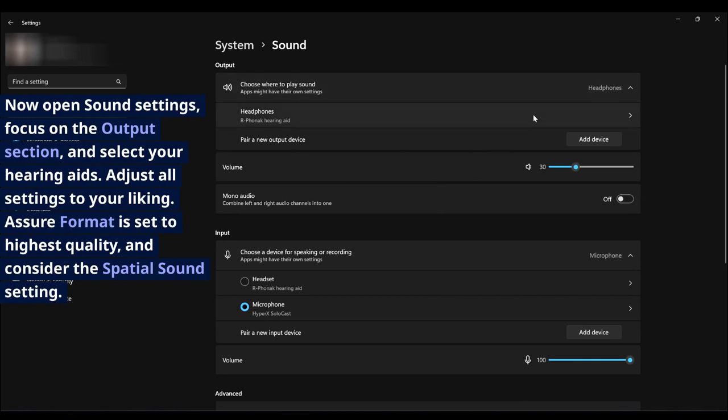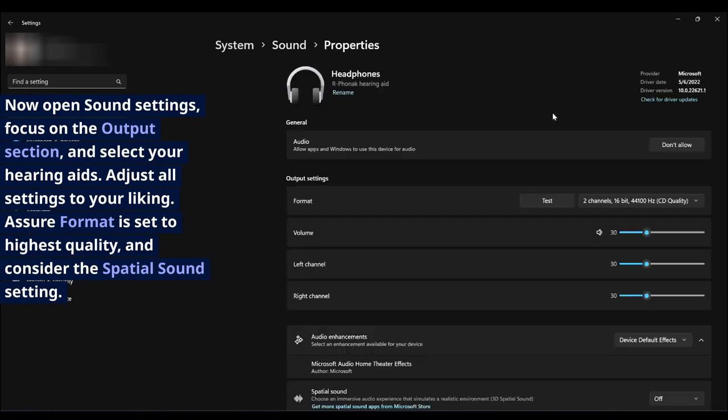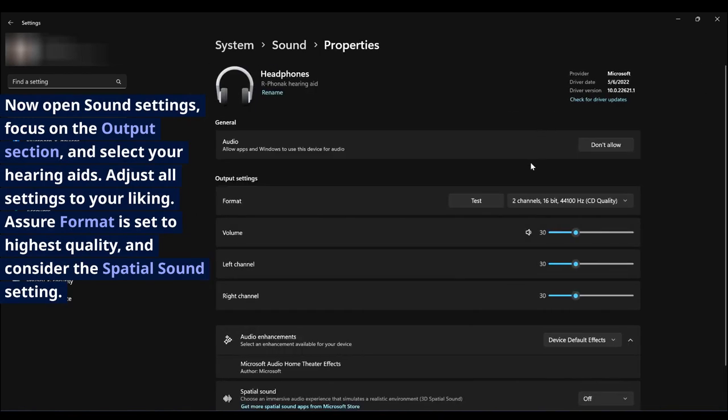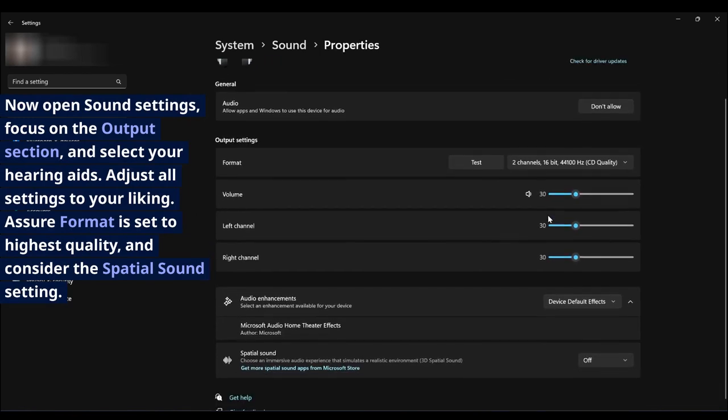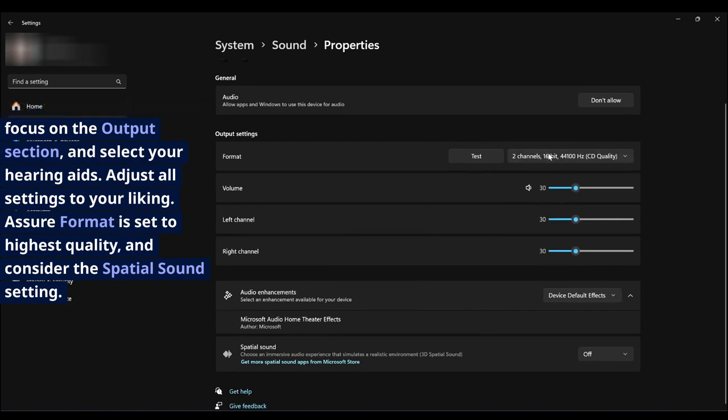Adjust all settings to your liking. Assure format is set to highest quality and consider the spatial sound setting.